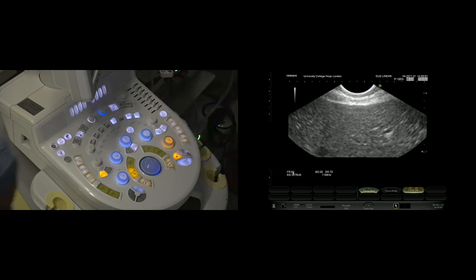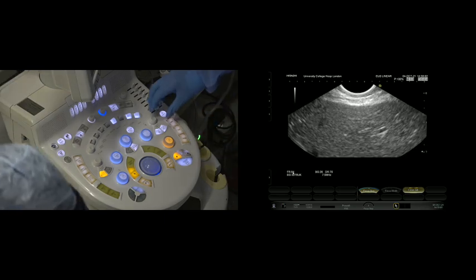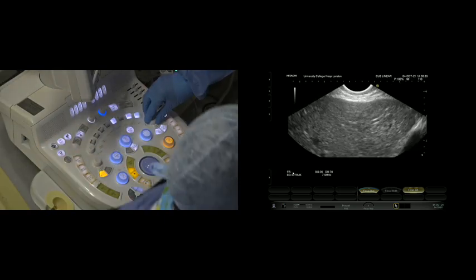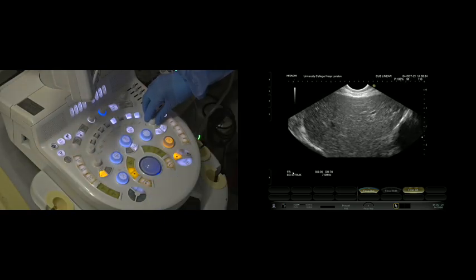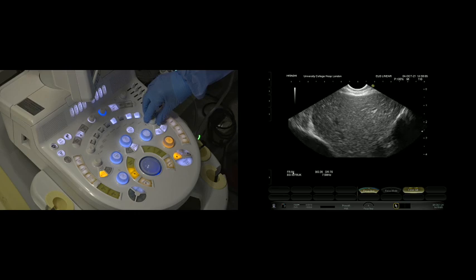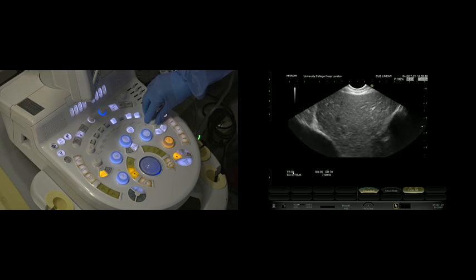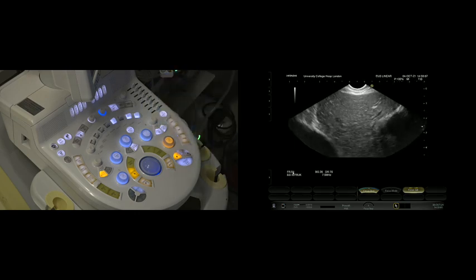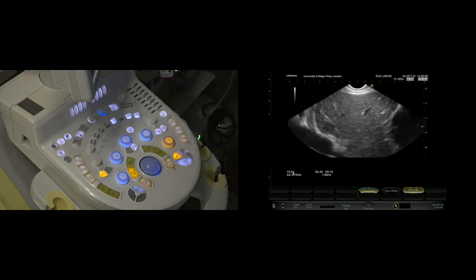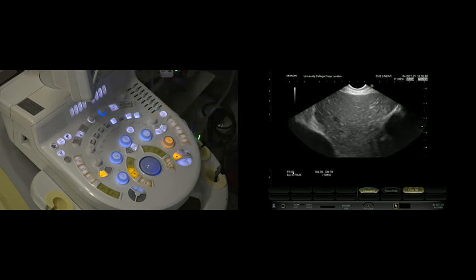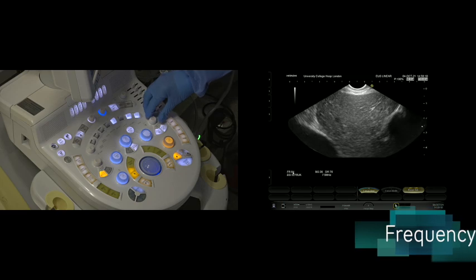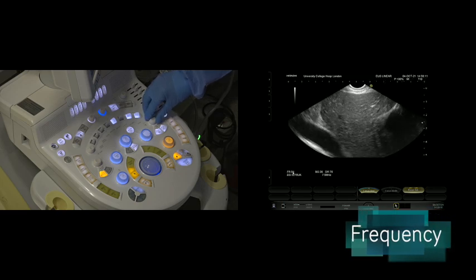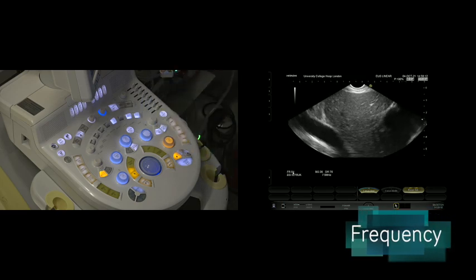Back to five here. The next thing is the frequency of the image, and this is a really crucial point to understand.